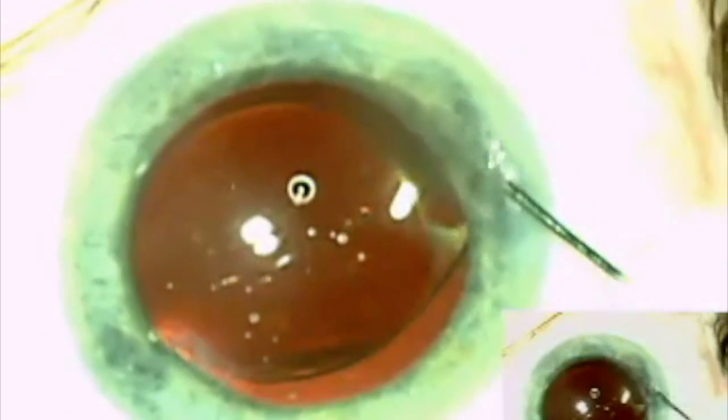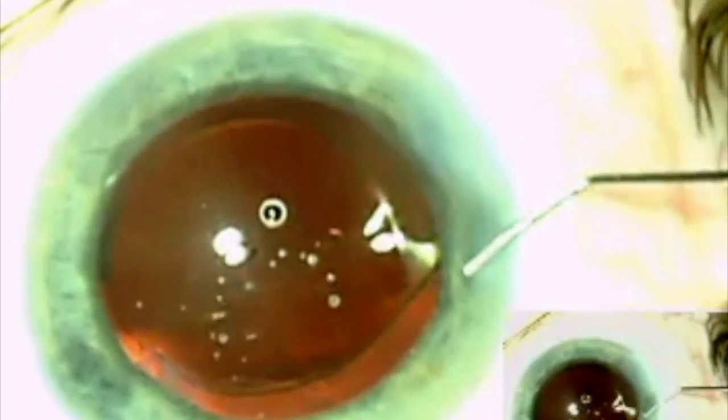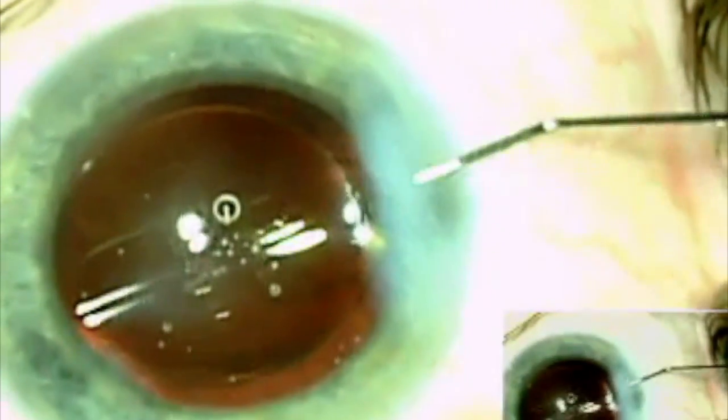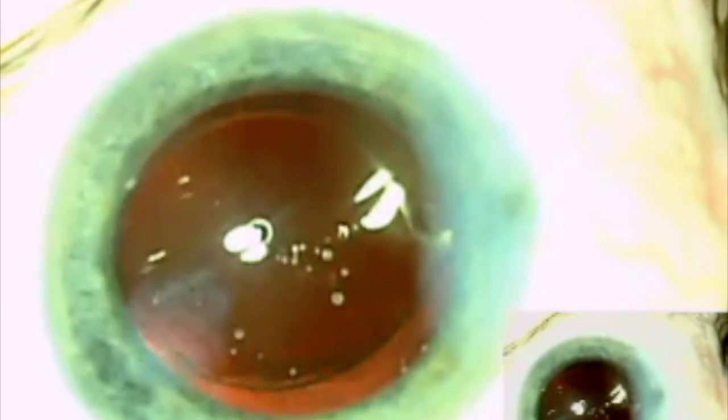Once the viscoelastic has been removed from the eye, the wound is hydrated and then checked with a Weck-cell spear to be certain that it is watertight without sutures.